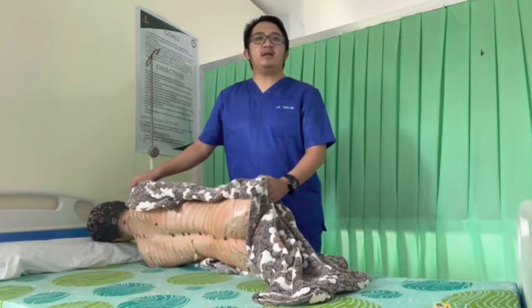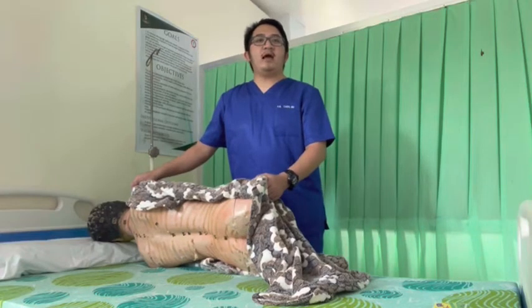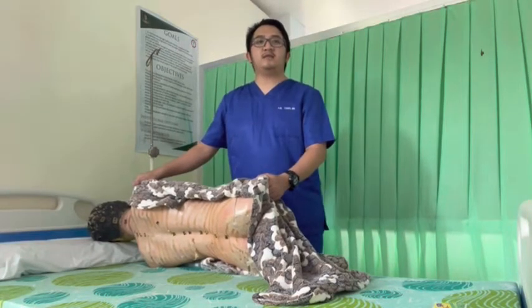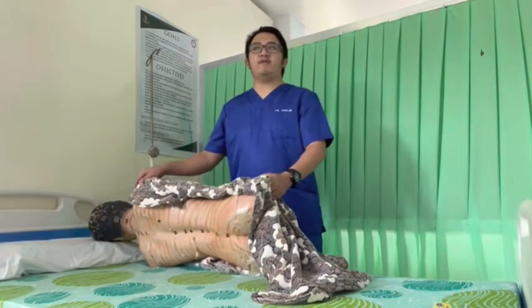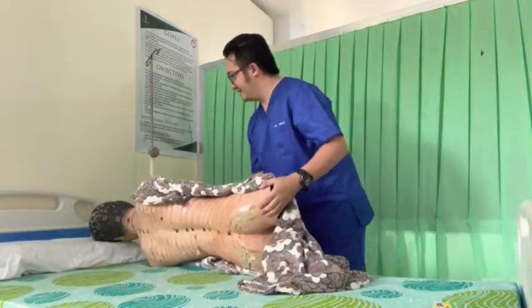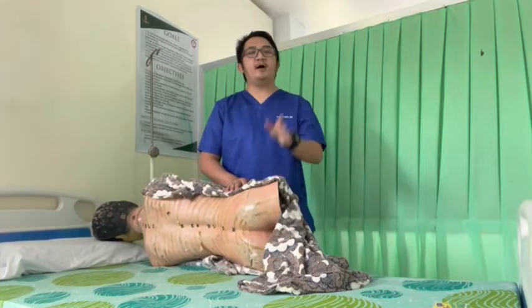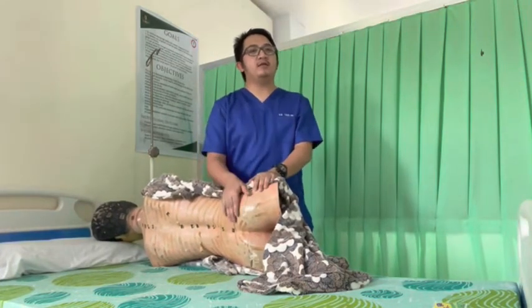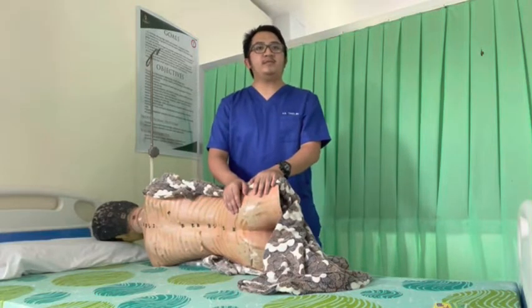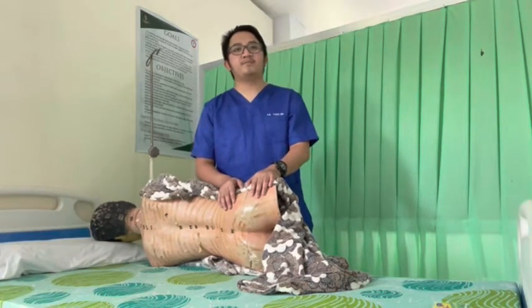The physician cleanses the puncture site with an antiseptic solution to prevent the spread of microorganisms. Assuming that I've already cleansed this part, the physician injects the local anesthesia.